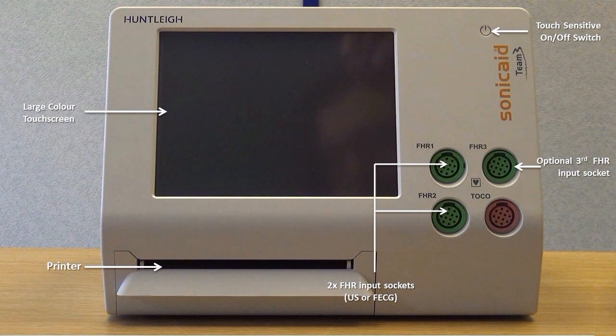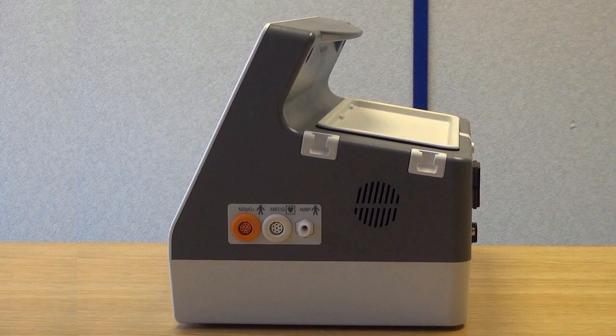A touch on/off switch, an optional third FHR input socket for triplet monitoring, and a contractions input socket.